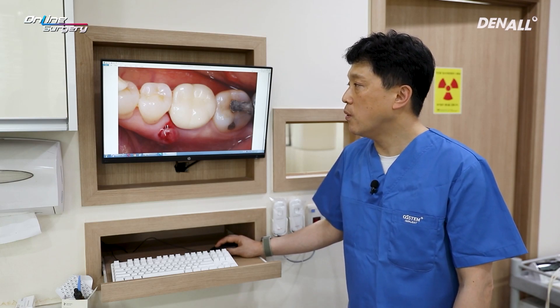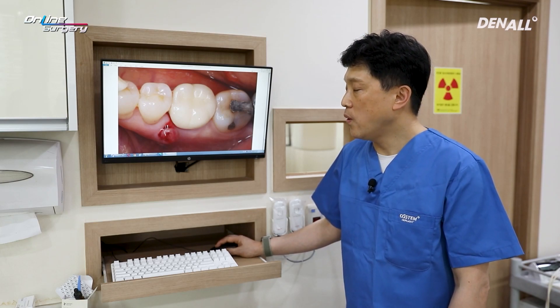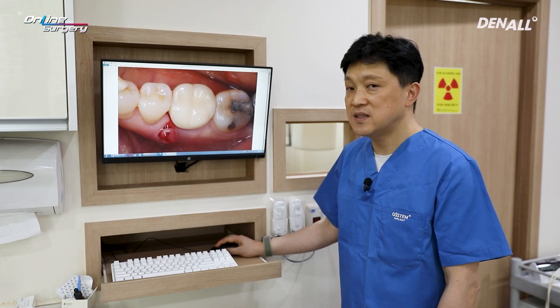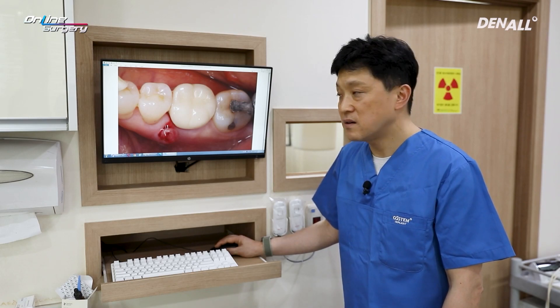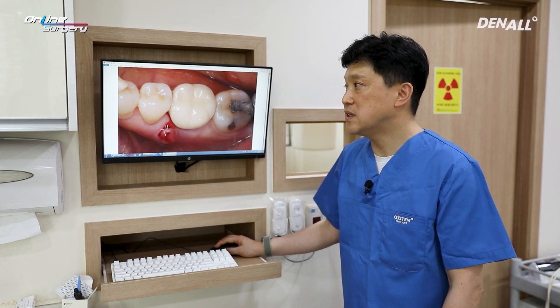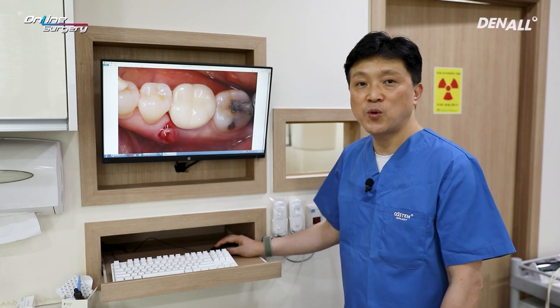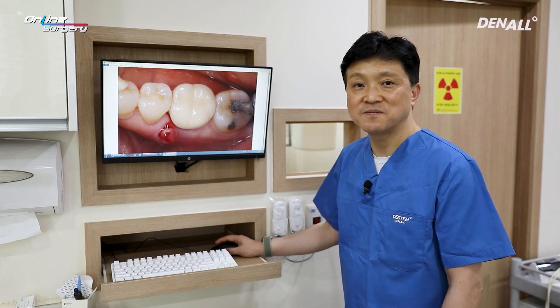The surgical video is about performing extraction of tooth number 46 and performing immediate implant replacement as well as transmucosal GBR.